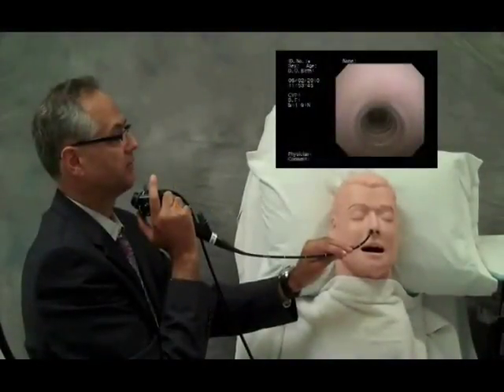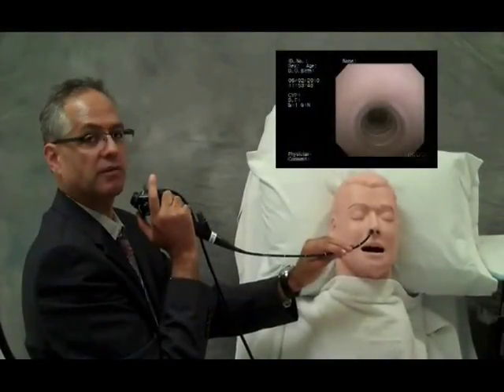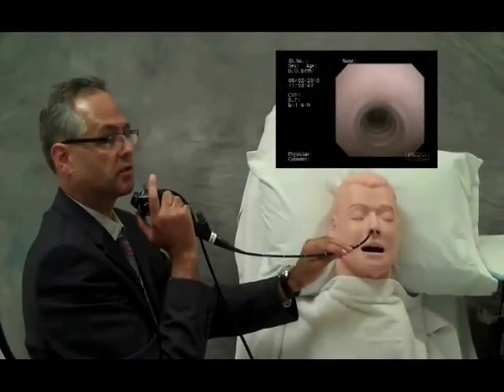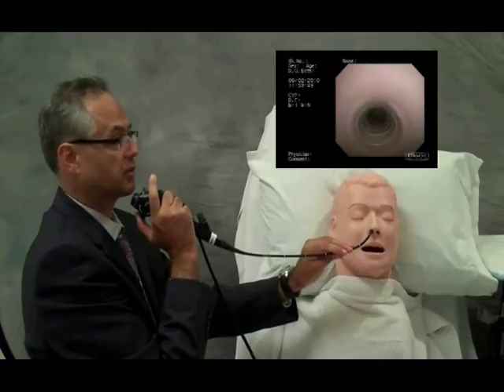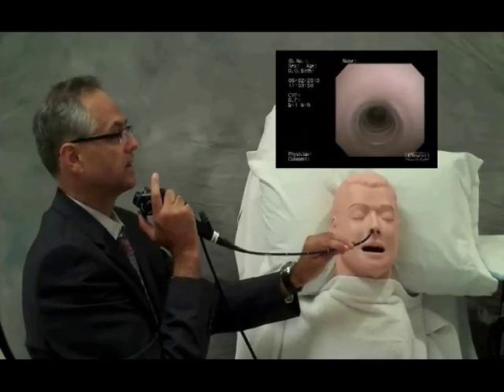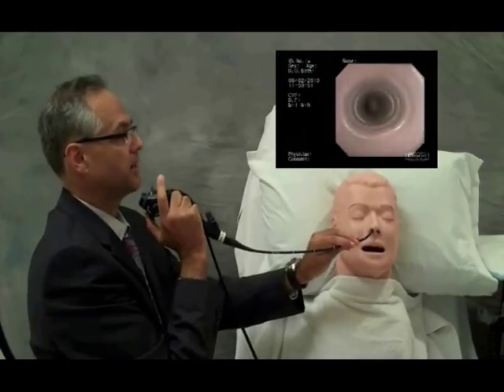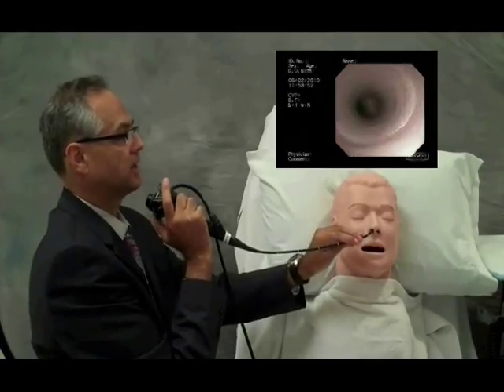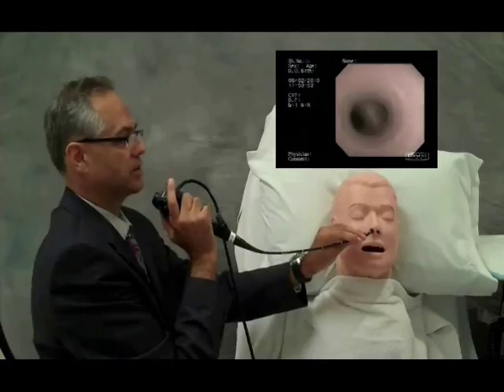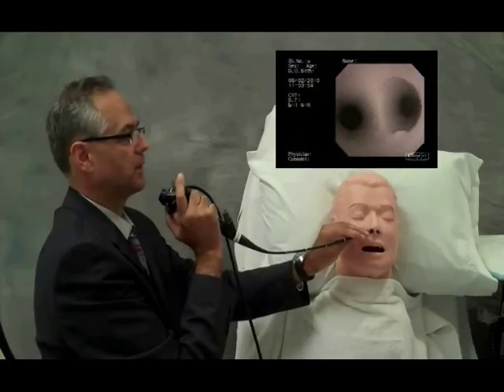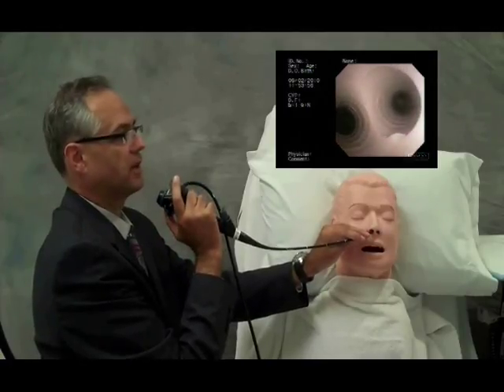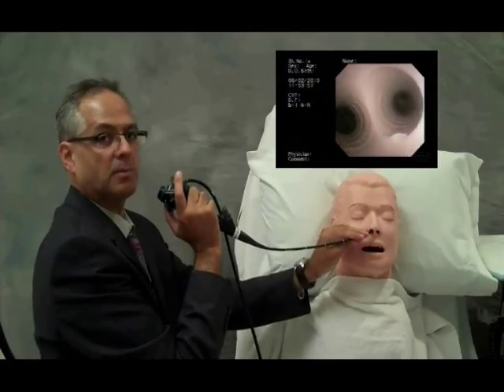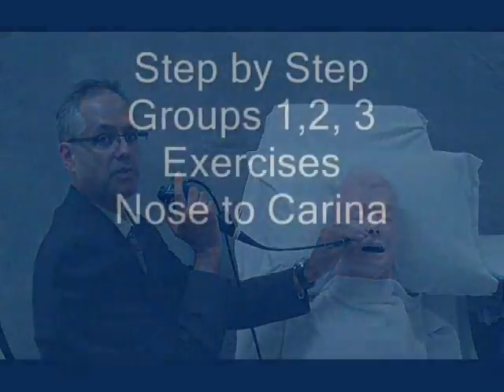Step 3 follows the curve of the trachea from the subglottis to the carina. The scope is kept in the midline, again using small manipulations of the bronchoscope itself to avoid trauma to the walls.